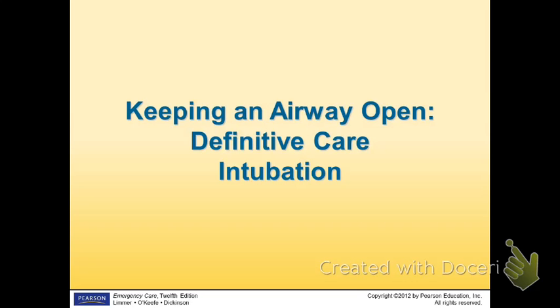That is called intubation. Now, you guys are not allowed to intubate, obviously. That's an advanced life support thing. But I want to show you intubation, because remember those facial responses. It happens every year when you see a patient being intubated and they're putting that breathing tube, an endotracheal tube. Endo meaning inside, right? They're putting a tube inside the trachea so they can breathe for the patient.